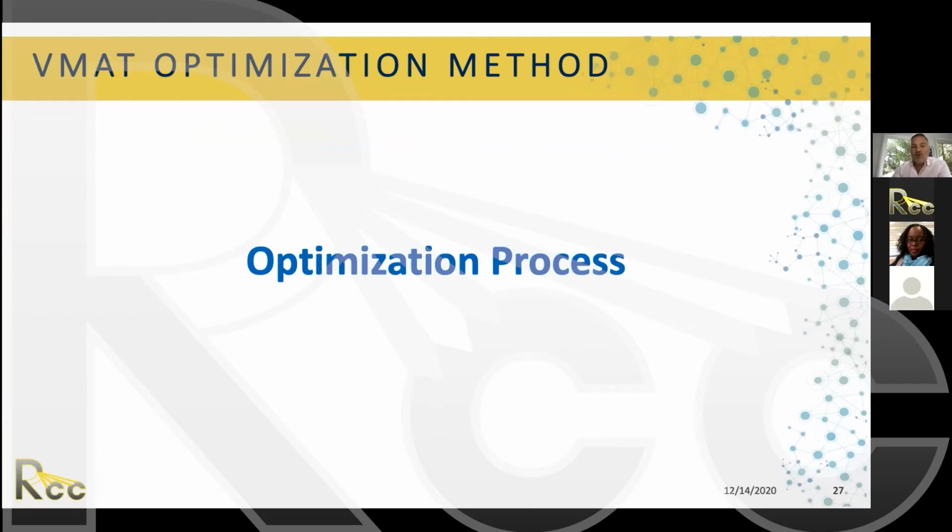So now I'm going to go to the optimization process. I don't know if you have any question on this, if there is anything on the chat. If not, I'm going to continue, because this is basically the main part.